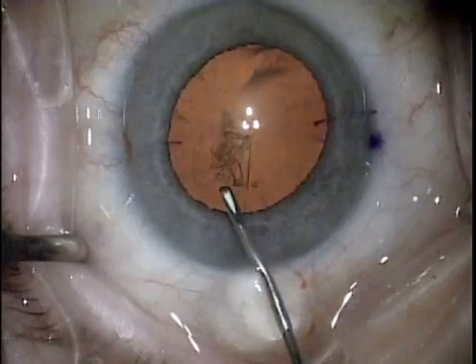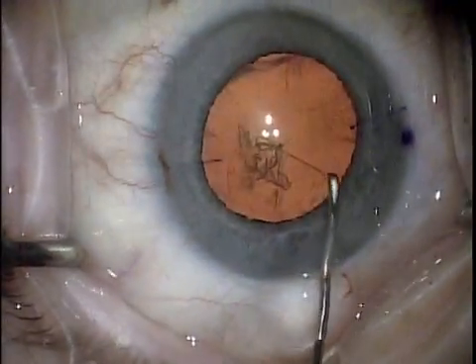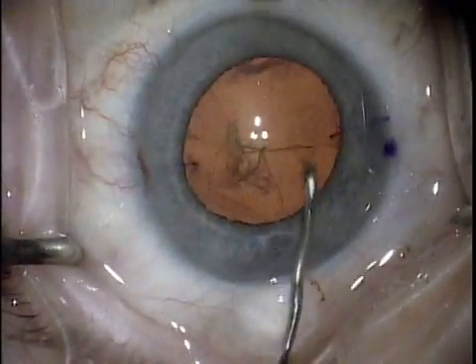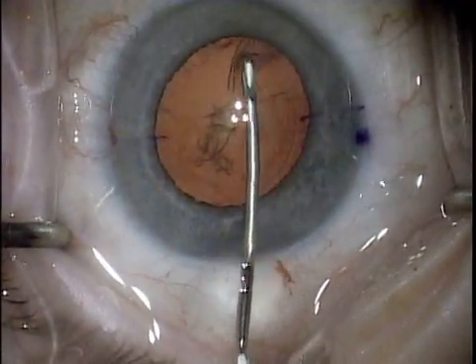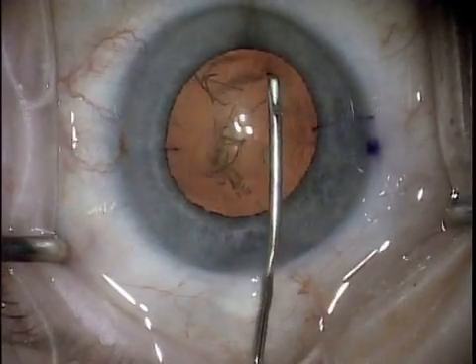As the ink lines are separated by 6 mm, they can be used to determine the size of the capsulotomy beneath them. Ideally, the capsulotomy should just cover the edge of the toric lens optic.